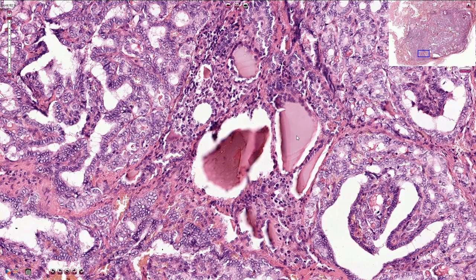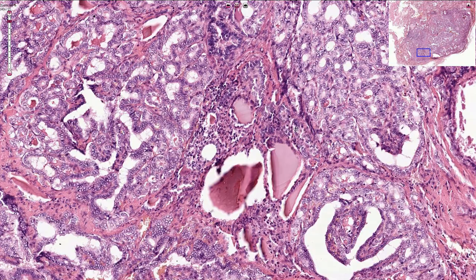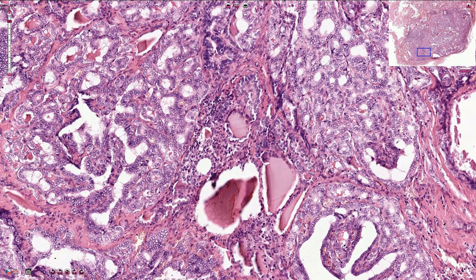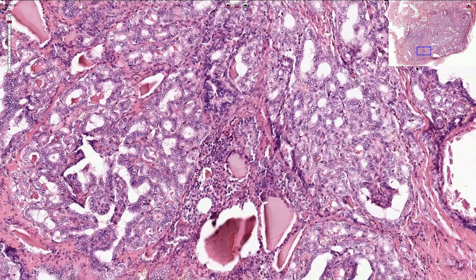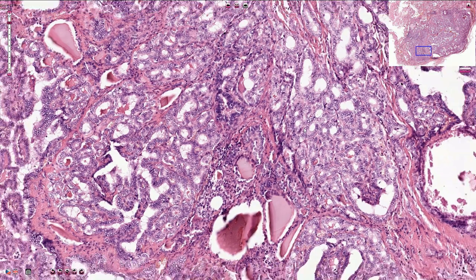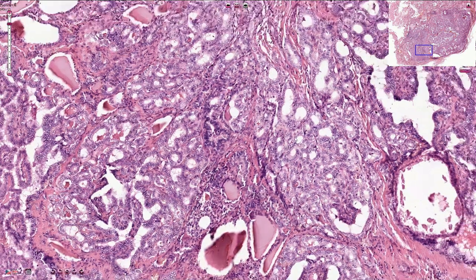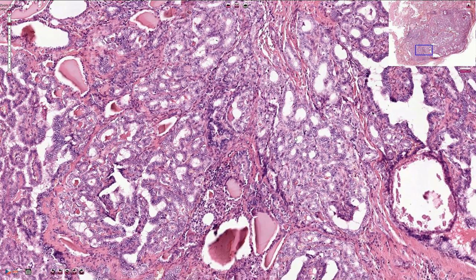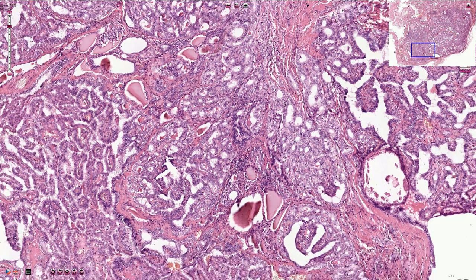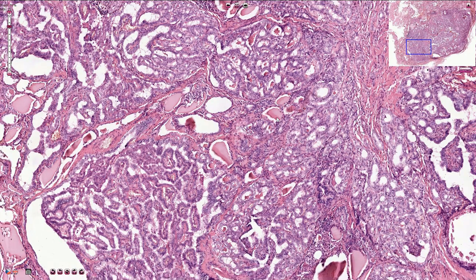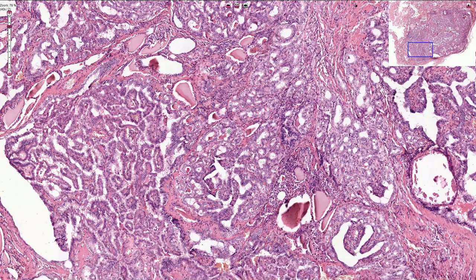Papillary carcinoma is sometimes associated with psammoma bodies, or concentric calcifications — small calcification bodies which are quite useful for the radiological appearance of the tumor. Sometimes we can also see multinucleated giant cells inside the colloid within these follicles.